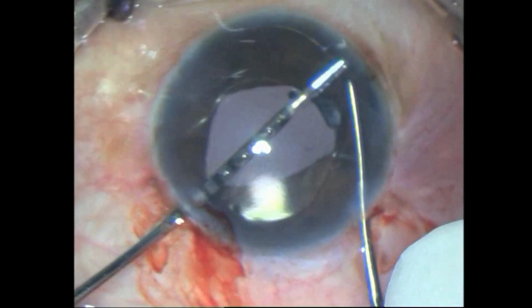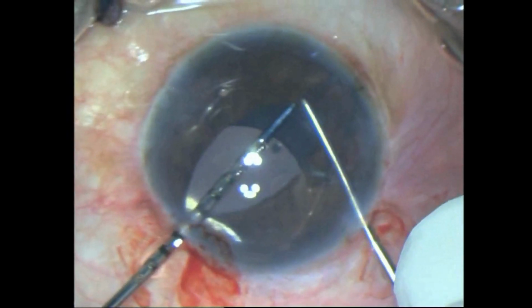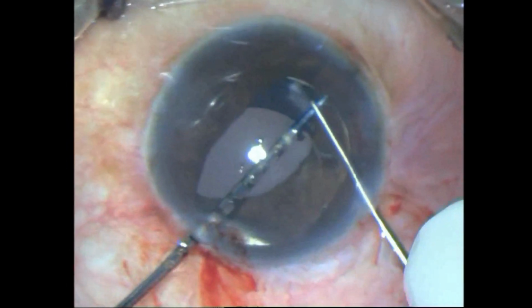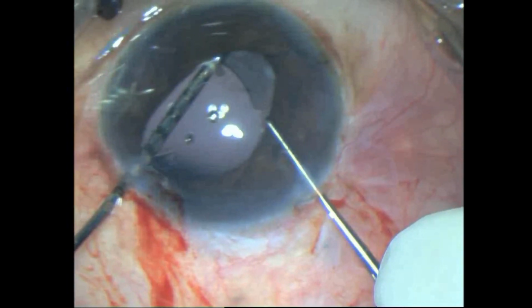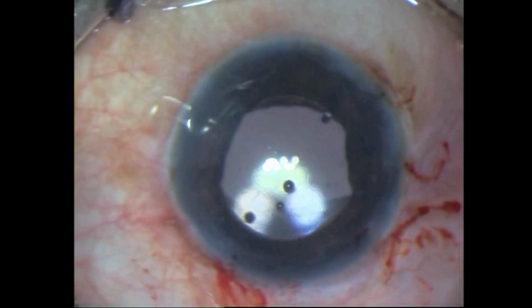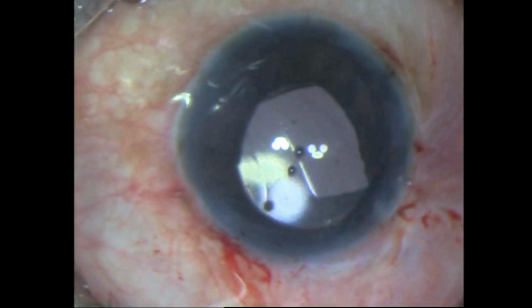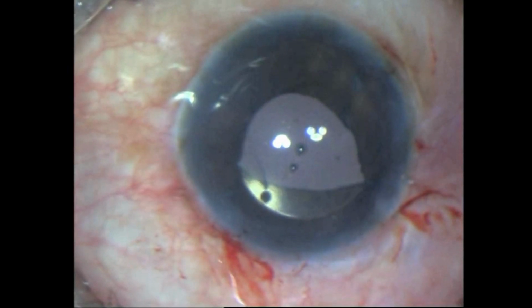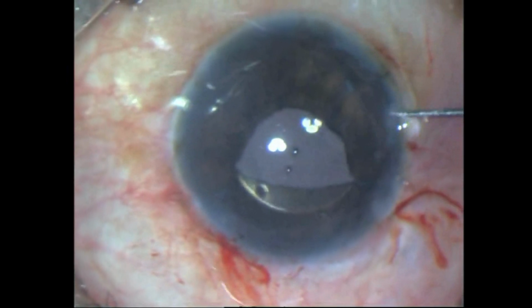All was going well, little difficult maneuver, but managed it. I then captured the optic with the pupil, and then I was planning to suture the haptics to the iris. I did one mistake here. I put in some pilocarpine thinking I would hook that optic properly, but instead of that, the lower edge of the optic went behind the pupil, and trying to retrieve that and bring it over the pupil, the upper optic also went below the pupil, and the pupil completely shut down on me.